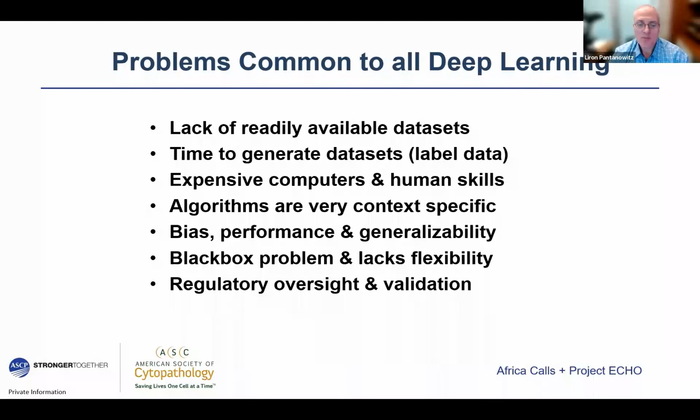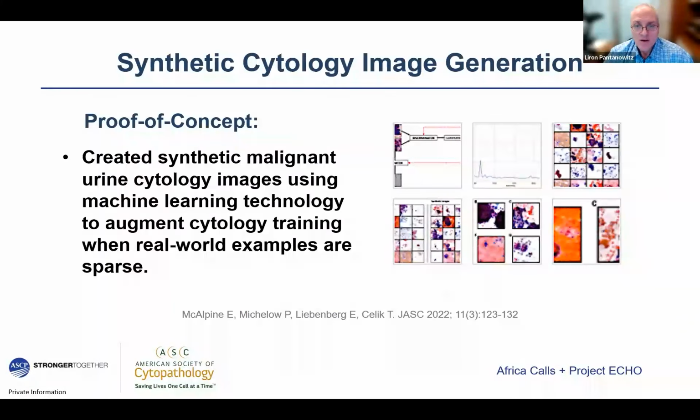We're also not quite sure about how regulations should oversee algorithms. Can they just sign out cases on their own? Do humans have to oversee this process? And as mentioned, how do you validate this? I gave you an example of what we did in our lab here in the USA, in Ann Arbor, Michigan, but there aren't standard guidelines out there on what we should all do. I think we do need a recipe we can all follow so that we're at least practicing safely.